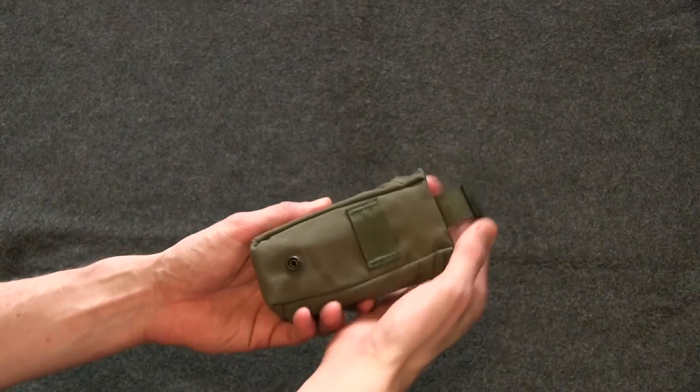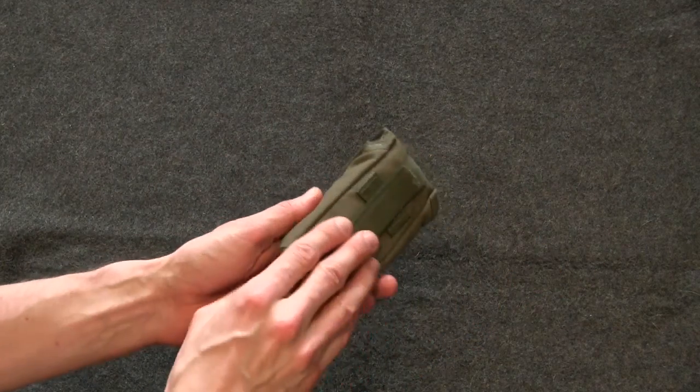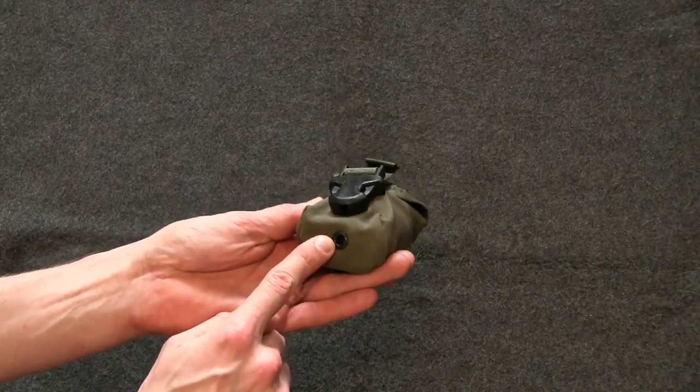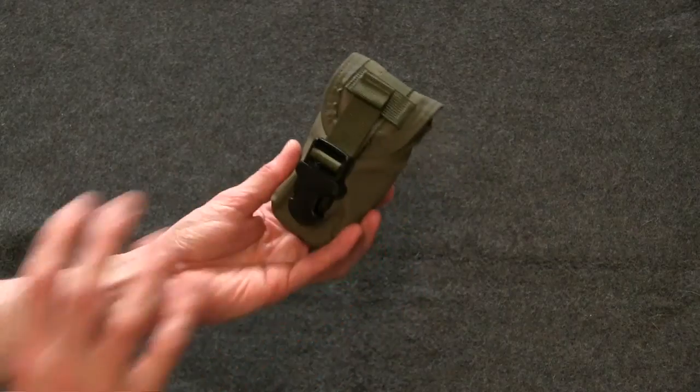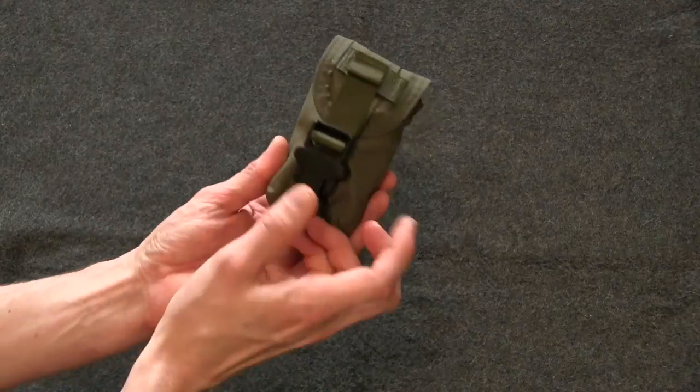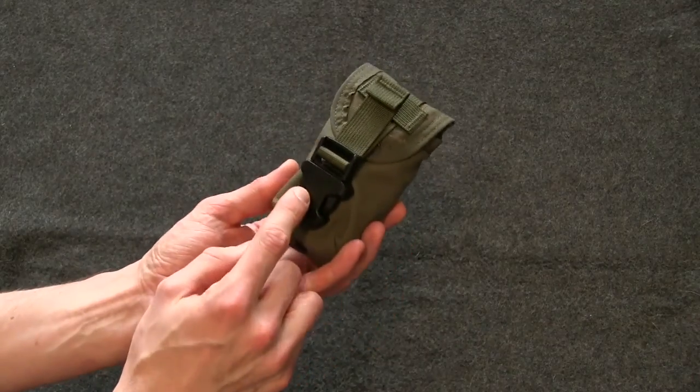It's a quite nice little pouch. There are MOLLE loops on the back, so you can easily attach this to your gear. There's a little drain hole on the bottom. I believe this is mostly watertight material made out of some kind of Cordura, and there is a plastic buckle in the front.